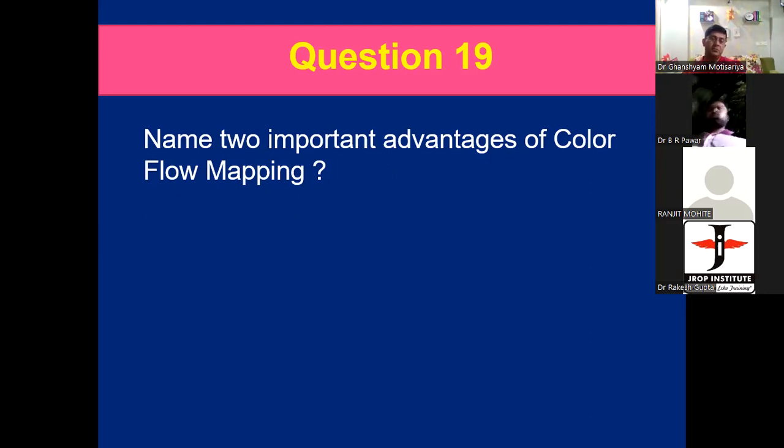The ease of use is the main thing. It quickly tells you about valves, stenotic lesions, and regurgitations. ASD, VSD, it tells you about that also.